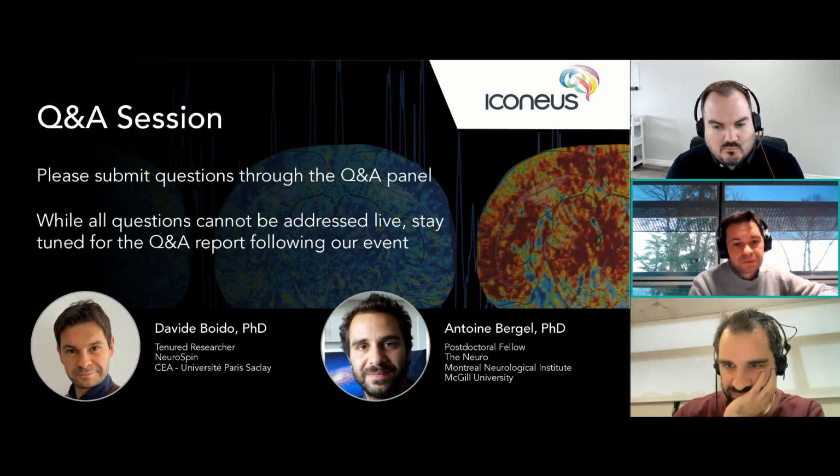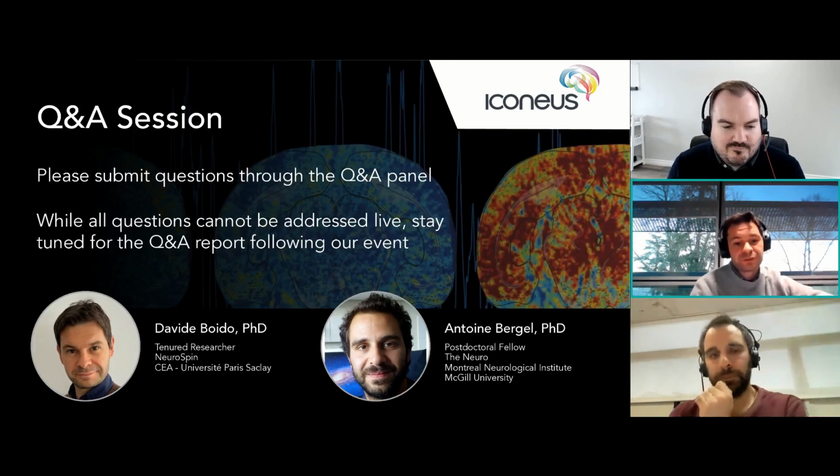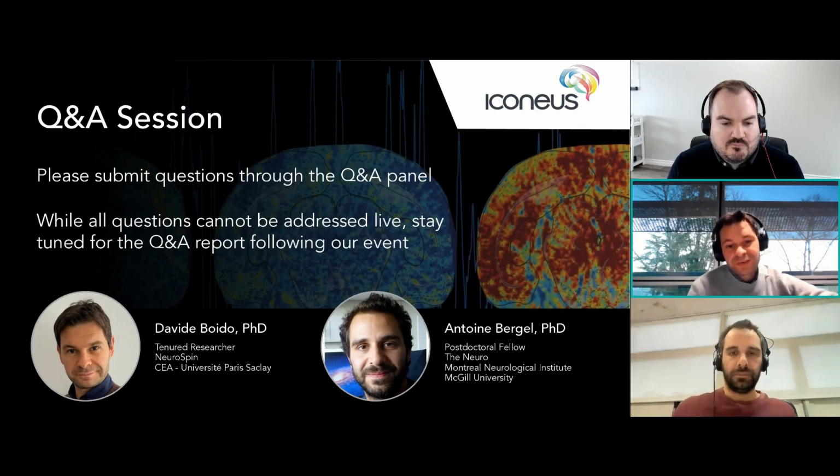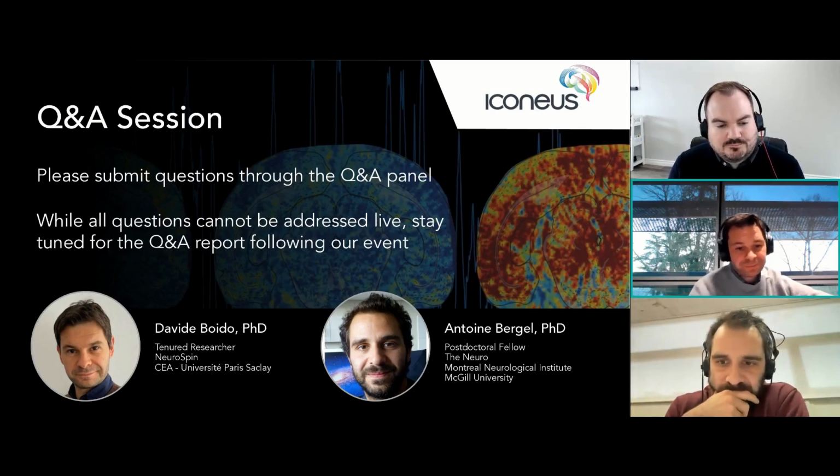If you use the same cover over the neocortex, you can shim fairly well, pretty much the same way you would shim in a naive mouse with no craniotomy, no cover. But the olfactory bulbs were really tough, and that's why we couldn't manage to go as fast as we wished with both fMRI.